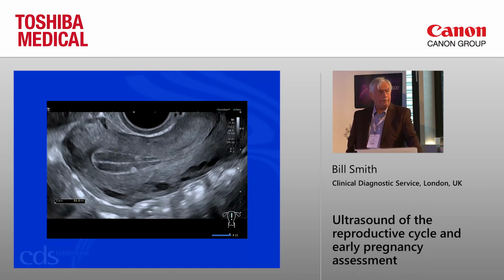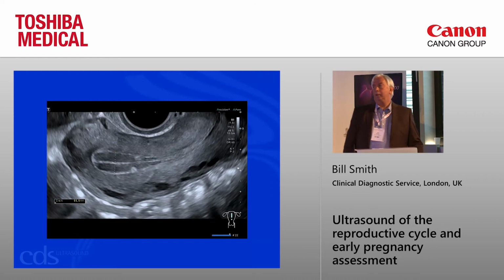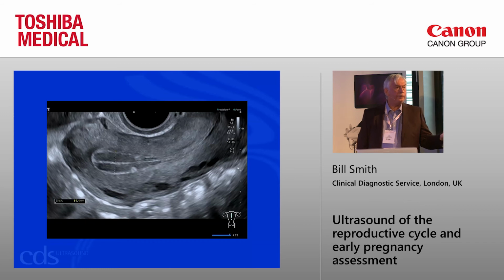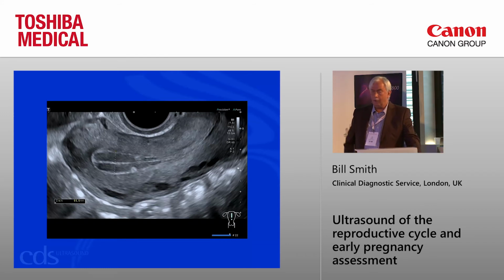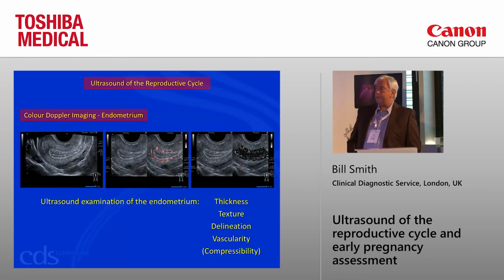And I think it emphasizes how the world of IVF in particular is missing out, because they do not look at the endometrium. I don't know of any IVF unit that looks at the endometrium after egg collection. I gave a lecture in Dubai on the luteal phase assessment in IVF pregnancies. Had nothing to say because IVF don't look at the luteal phase. But you can see how important it is in terms of assessing the endometrium.